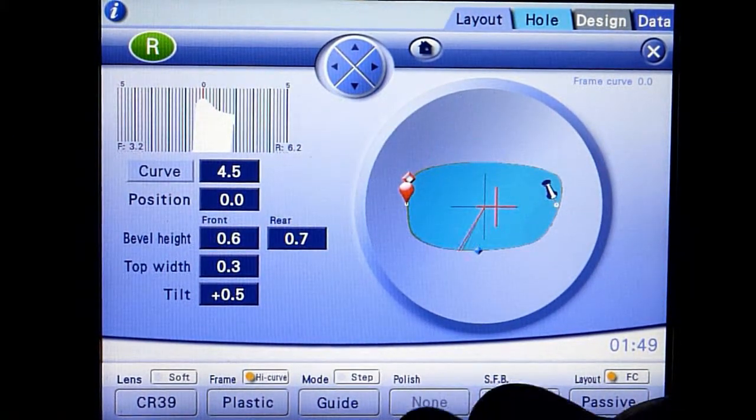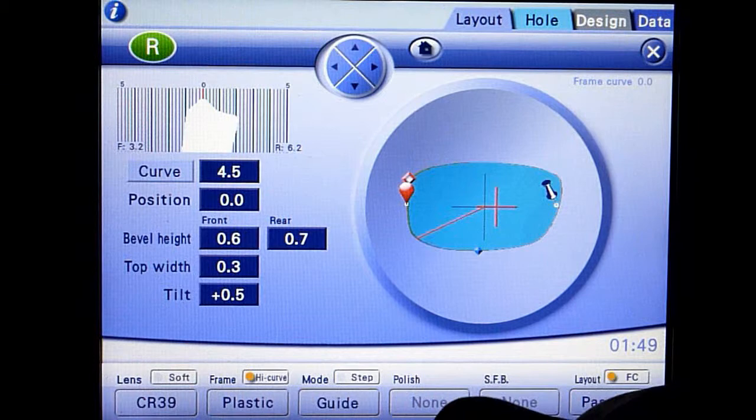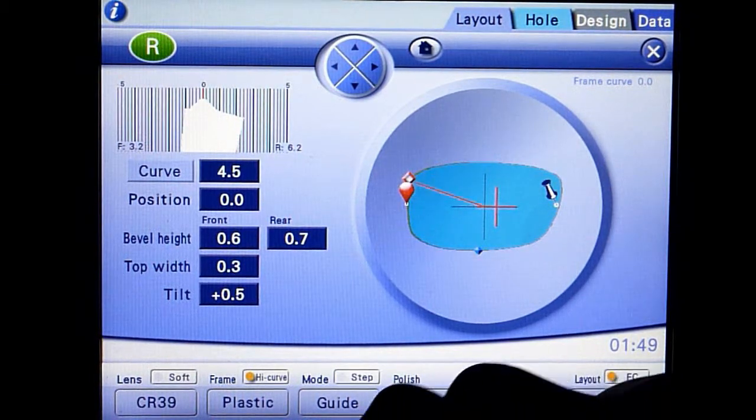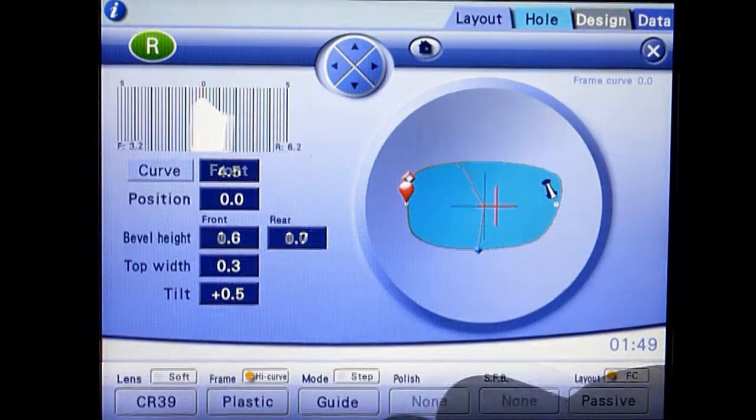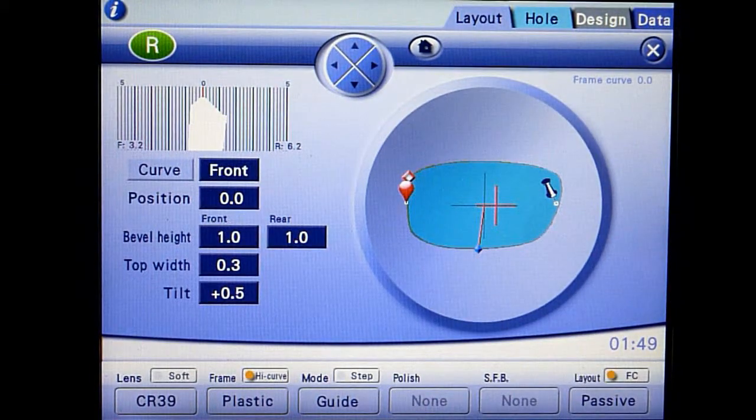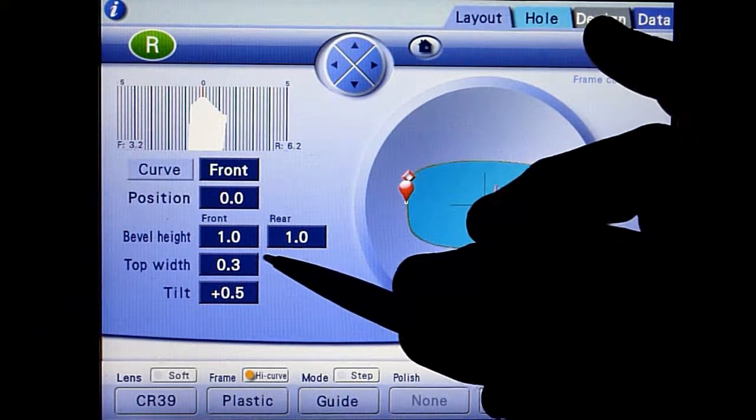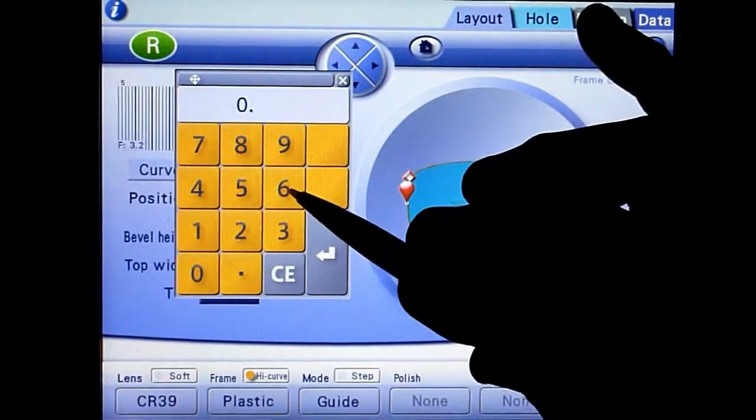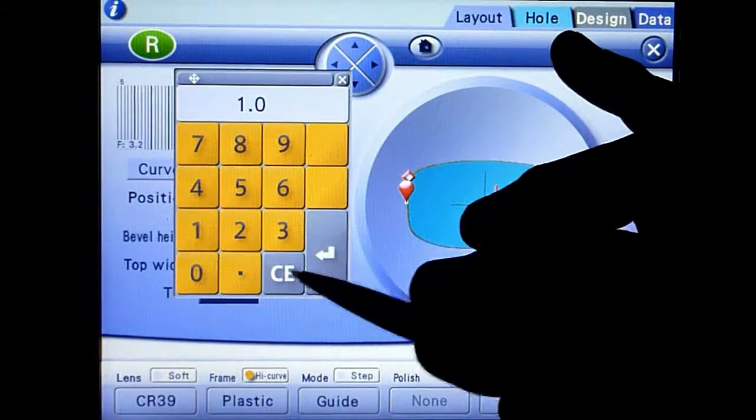Turn the jog dial to view the bevel placement and lens thickness profile. Adjust bevel height front and rear values to 0.6 and 0.7 millimeters respectively.